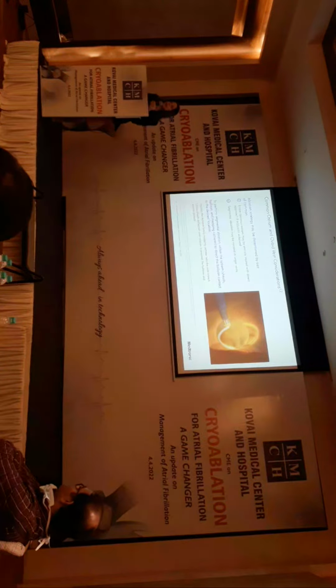So today, we did treat a common vein. Common veins are not uncommon, and a lot of times the staff will run and tell me, well, this patient has a common. I've had patients that have even had anomalous veins that empty into the right heart. There's always a way to approach all the pulmonary veins as long as they have potentials that need to be ablated. Some of these details are more for the user.